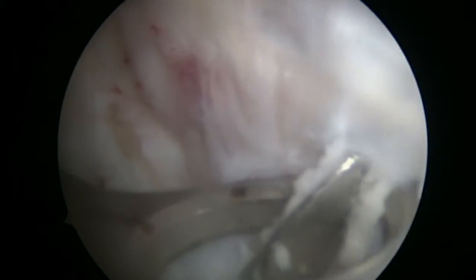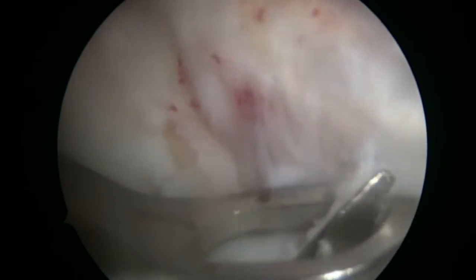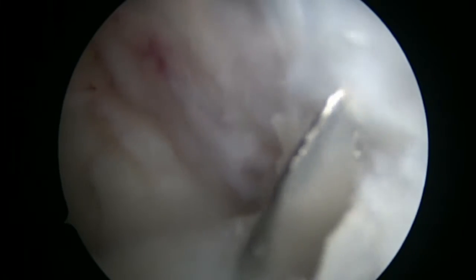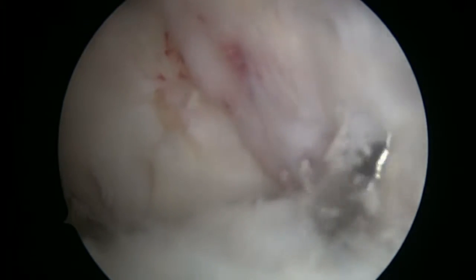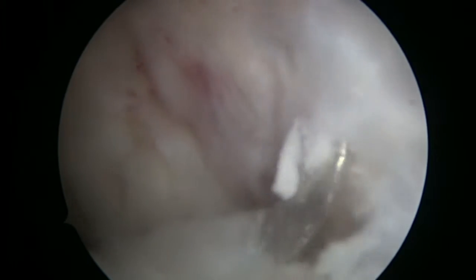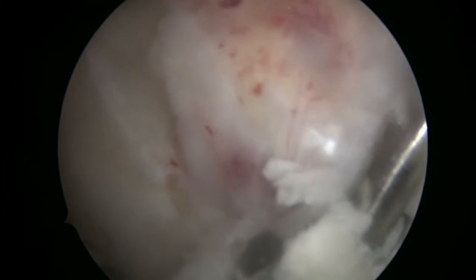This is the guide pin over which we will be drilling the tibial hole. Depending on the size of the graft, which was sized separately on the side table, for this procedure we chose a size 8 drill. As you can see, it is entering the joint now.